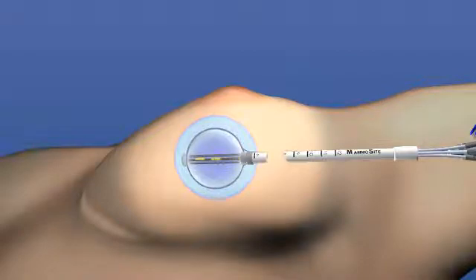Using the mammocyte multi-lumen device, the radiation oncologist has the ability to shift the radiation dose to the areas that need it most and away from the areas that do not need it, like the skin and the chest wall.